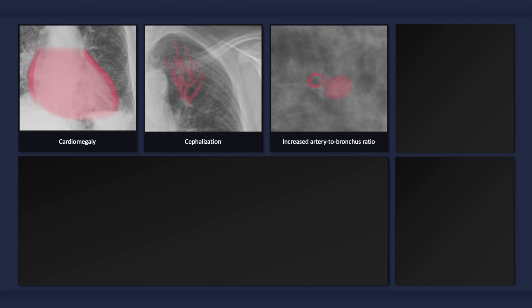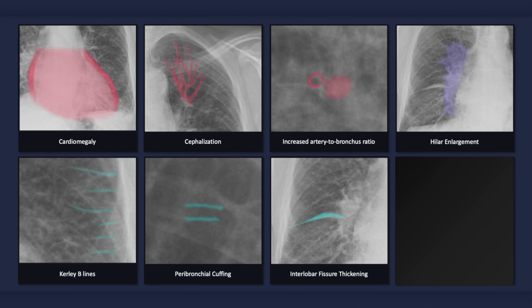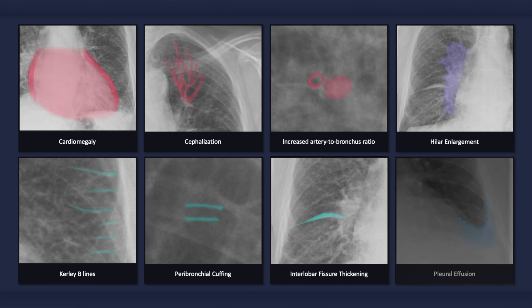To quickly recap, the plain radiographic findings that can occur with congestive heart failure include: cardiomegaly; signs of vascular redistribution such as cephalization and increased artery-to-bronchus ratio in superior segments; signs of pulmonary vascular congestion such as hilar enlargement and a widened vascular pedicle; signs of pulmonary interstitial edema such as Kerley B lines, peribronchial cuffing, and interlobar fissure thickening; pleural effusions; and in more severe cases, alveolar edema.